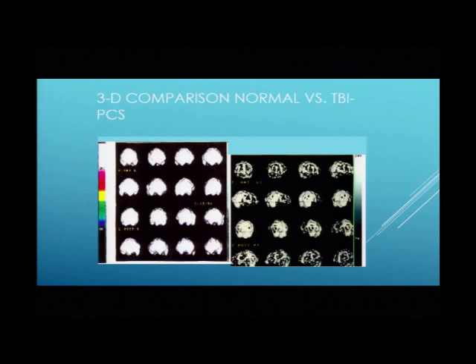So the next slide is the recapitulation to give you a better visual comparison. Okay, here's the normal. Here's the flow scale. There's the white. Everything is like Snow White and the 16 Dwarfs, because there's 16 pictures, right? And here is the one that I just showed you on the slide before. I think even a layperson can see the difference, right? Wouldn't you agree? So that's how we can diagnose it on a SPECT scan. And this person probably had a normal MRI and a, quote, normal EEG.